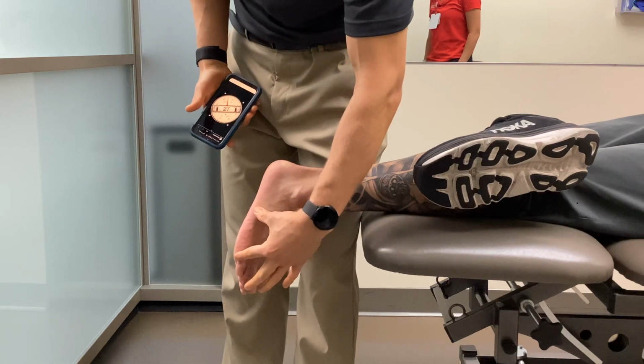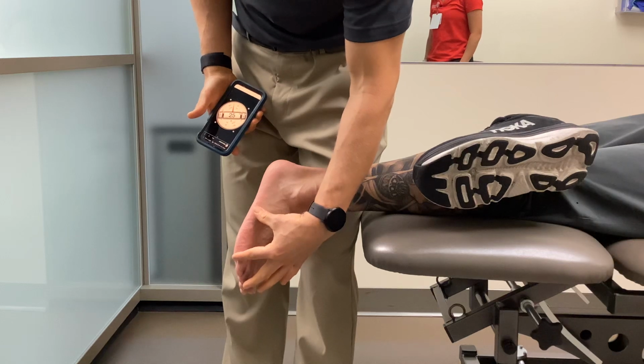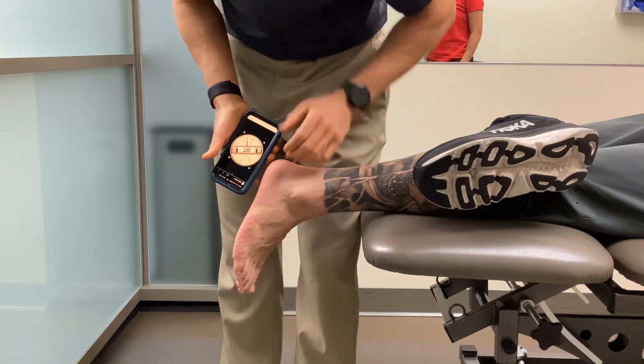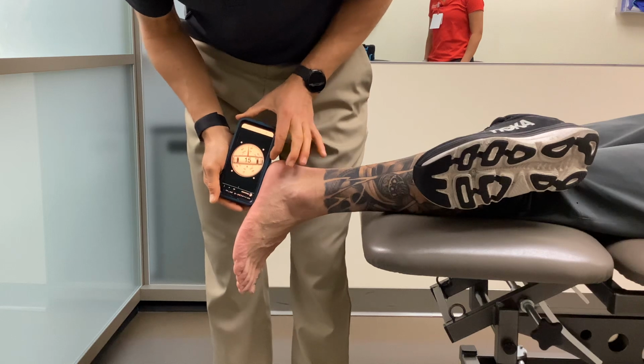we have the forefoot. Depending on what you're most interested in, right? So there are certainly performing arts athletes and such, where you actually may want to have a forefoot plantar flexion. For this instance right now, you're focusing predominantly on the hind foot.